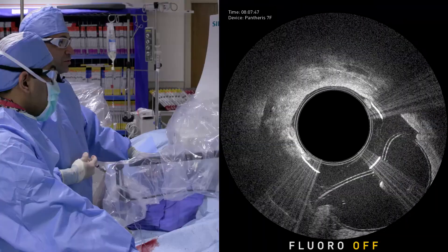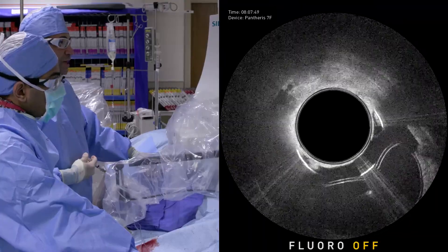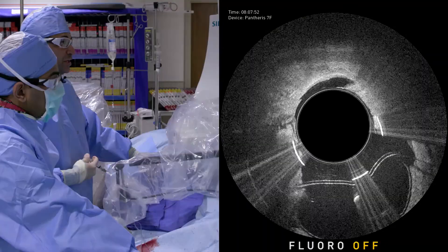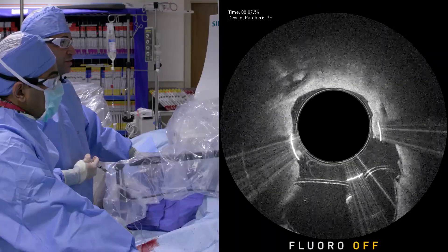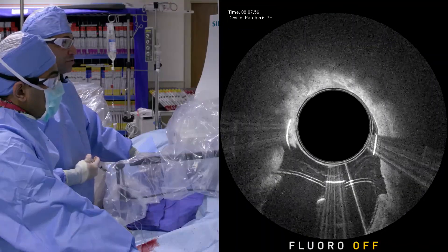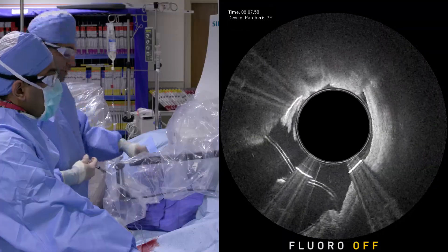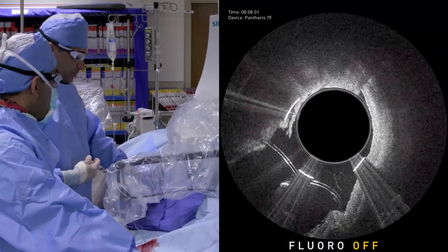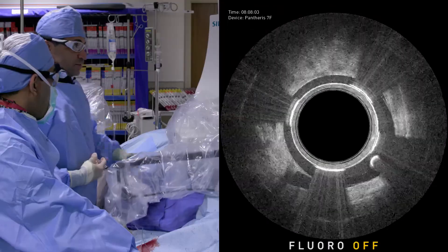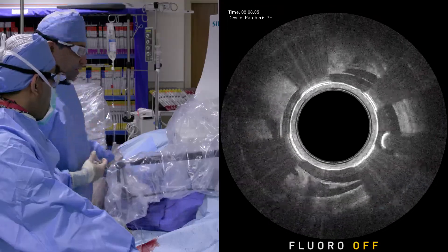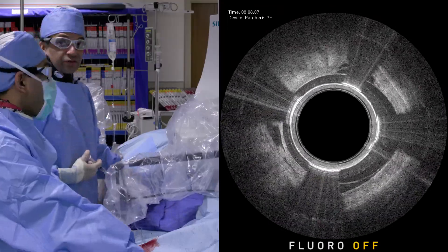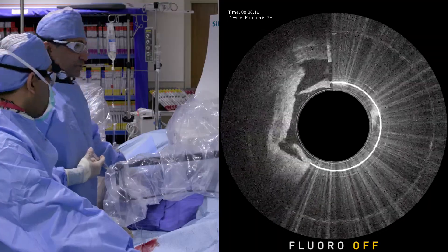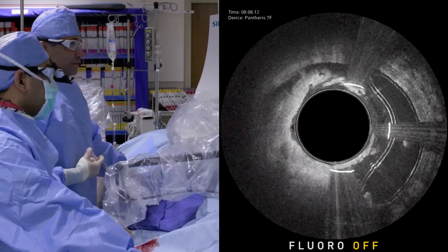We're getting close, but we're still okay. And remember, you don't have this type of capability with any other device. Your ability to visualize — they're a little close there. How we got that close? If I had any other atherectomy device — so I'm closing first, then I'm deflating my balloon. Any other atherectomy device, I would cut right through that. I would be cutting through media adventitia and really not being able to identify my layers.